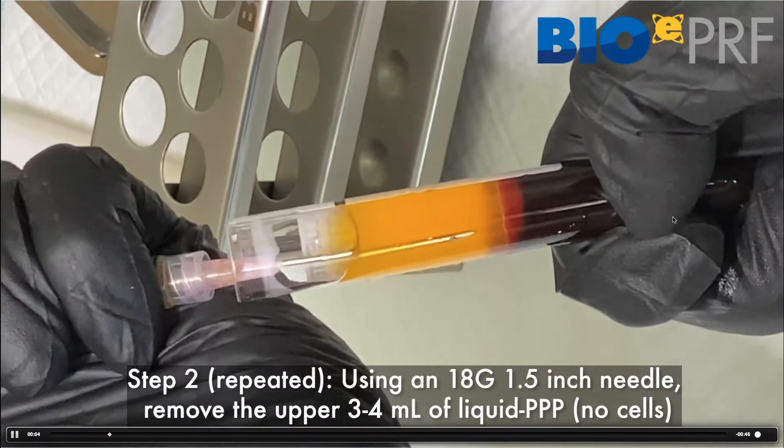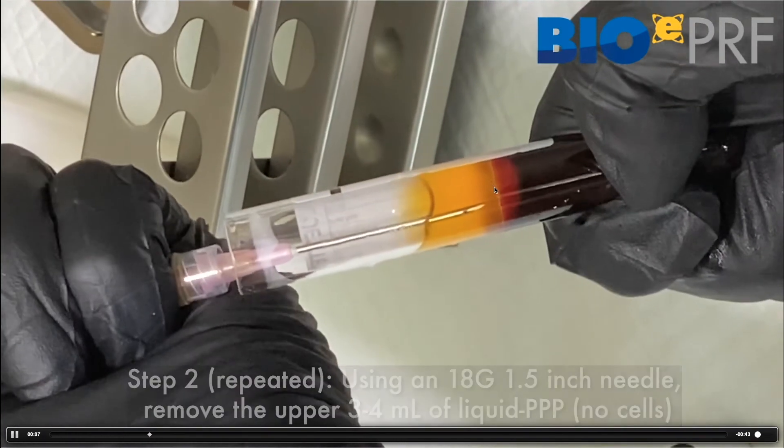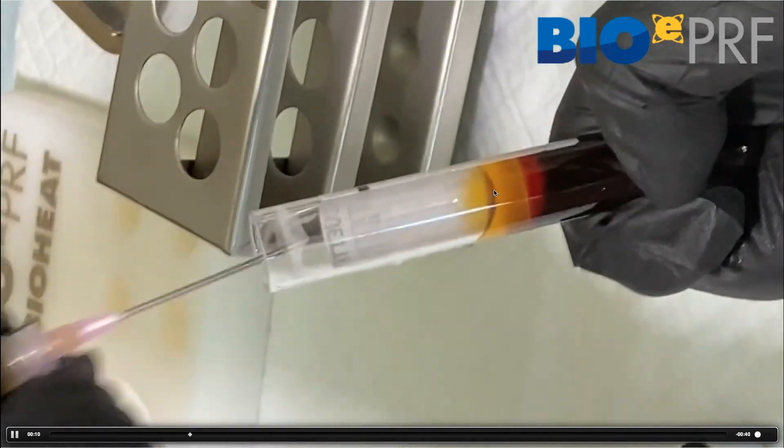So again, we're going to go over that. When you look at this video, you can actually see a little bit of the white there. That's where the cells are. So you're going to draw up this upper layer.